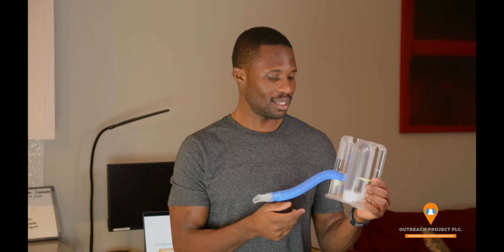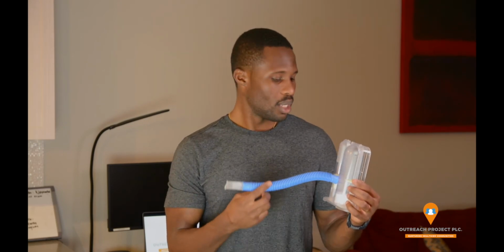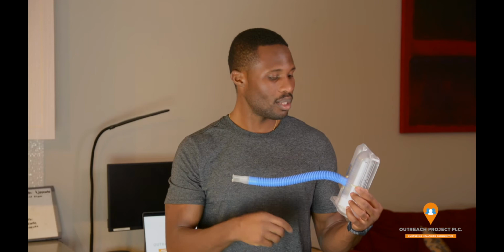Typically, most people will inhale very rapidly and this just shoots up. So what you want to do is correct that and say, okay, keep it within this clear region. That means you're going to have to take slower breaths. As they're inhaling, you just tell them, okay, that's good, keep it there, keep it there. Once they go up too high, tell them to keep it down just a little bit, or take it up a little bit more.